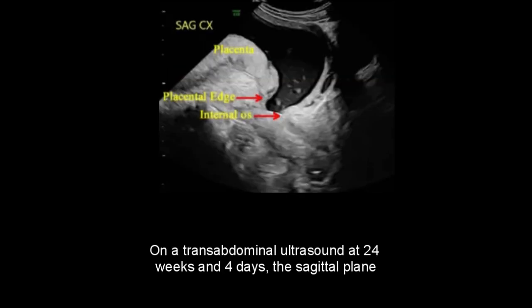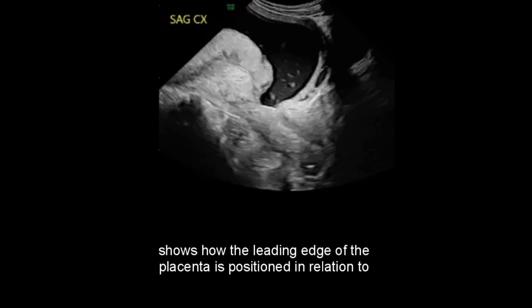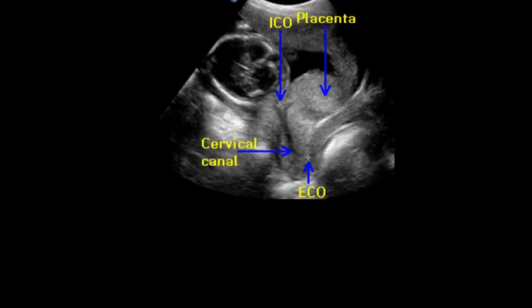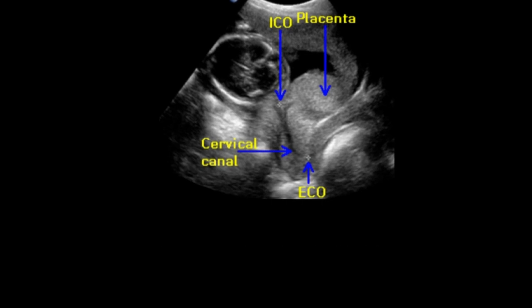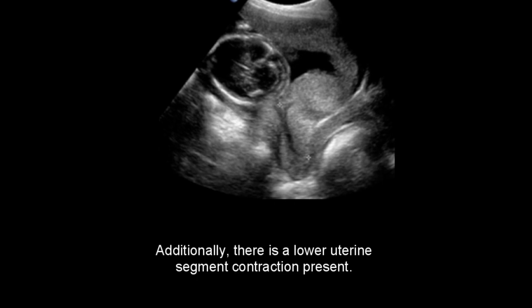On a transabdominal ultrasound at 24 weeks and 4 days, the sagittal plane shows how the leading edge of the placenta is positioned in relation to the internal cervical opening. During a 20-week transabdominal ultrasound, the sagittal plane reveals the presence of placental tissue near the internal os. It's important to note the external cervical os is located at the proximal end of the vagina, and there is a lower uterine segment contraction present.